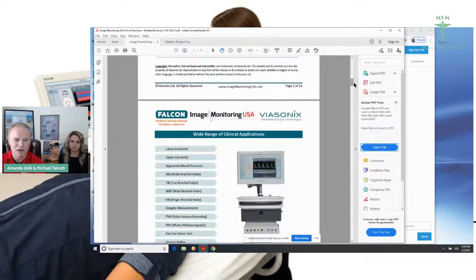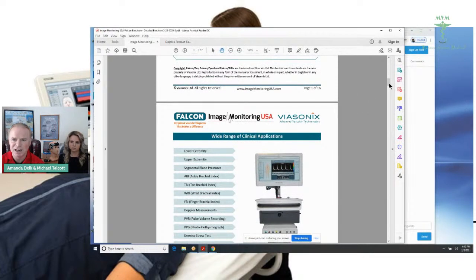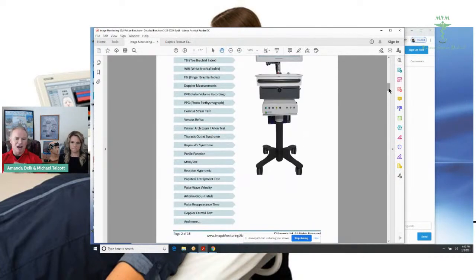The patients that we're looking at doing, or the studies that we would like to do on this, are studies like reactive hyperemia. That's going to tell us if a patient has peripheral vascular disease in the lower extremities. Palmar arch exam. Palmar arch exam tells us whether the patient has a patent palmar arch. So if you're doing any patients where you're doing radial access or radial harvest for heart surgery or heart cath, you really need to do a palmar arch exam beforehand, because that'll tell you if the patient's at risk. If that radial gets damaged, tells you if that patient's at risk for losing or having poor circulation afterwards.